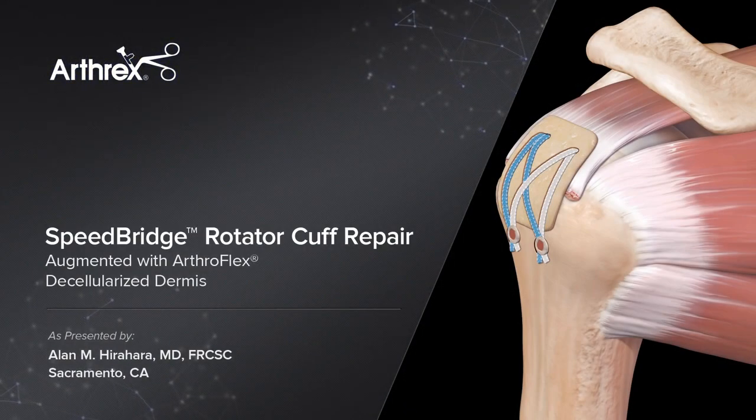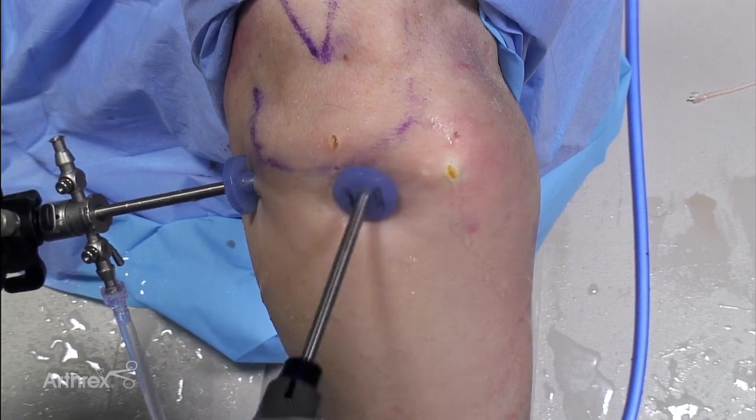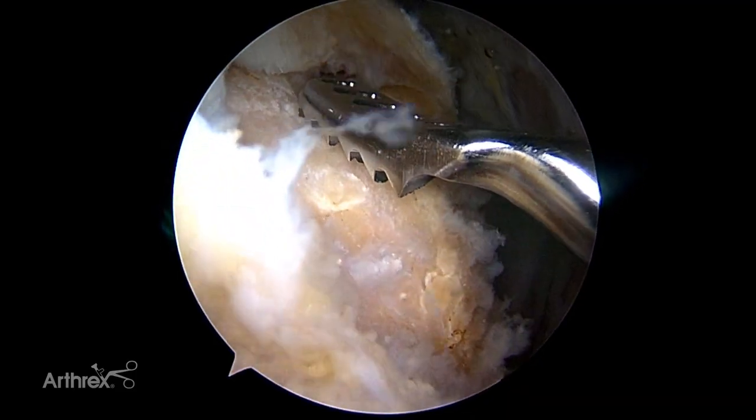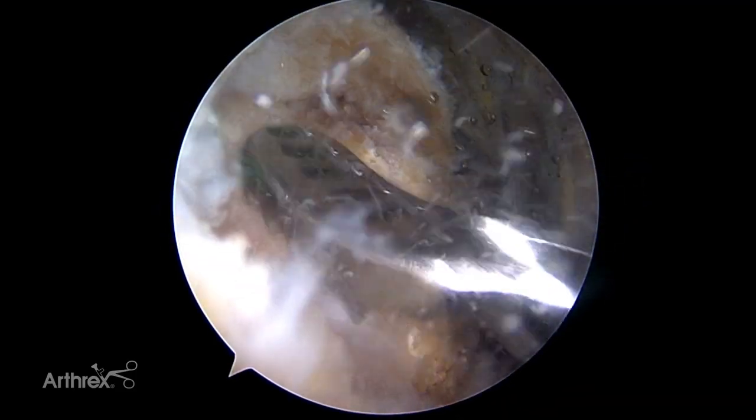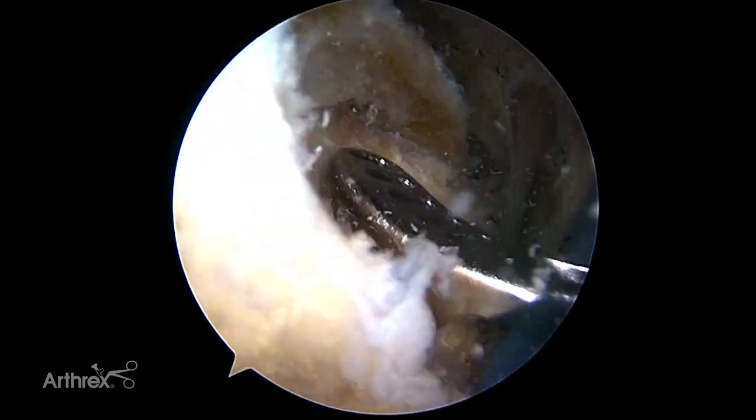This is Alan Hirajara speaking on the Speed Bridge Rotator Cuff Repair augmented with ArthroFlex Acellular Dermal Extracellular Matrix. The ArthroX Speed Bridge is a knotless double row rotator cuff repair that combines fully threaded swivel lock anchors with fiber tape to create a strong and low profile construct while minimizing surgical steps.